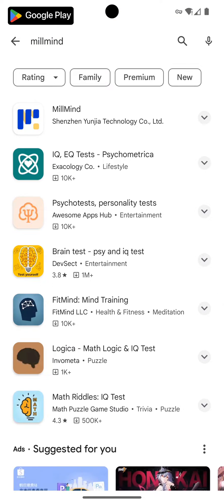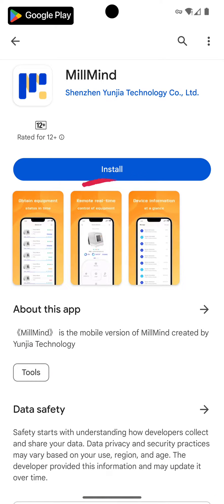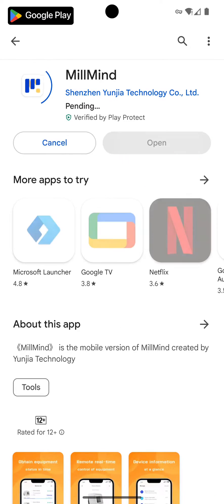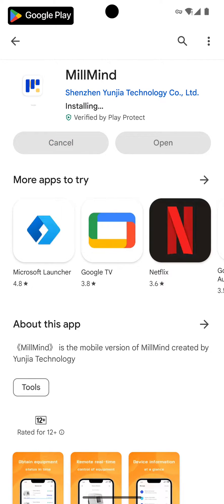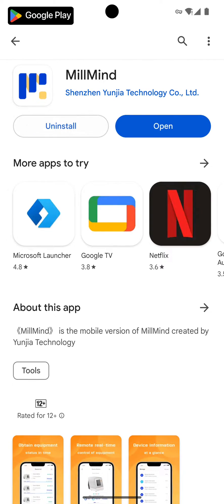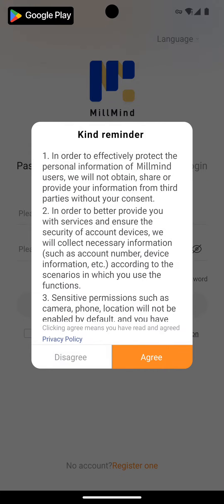Find the MillMind software in the search results and click on it. Click install and wait for the software installation package to download. When the download is complete, click open to open the software.